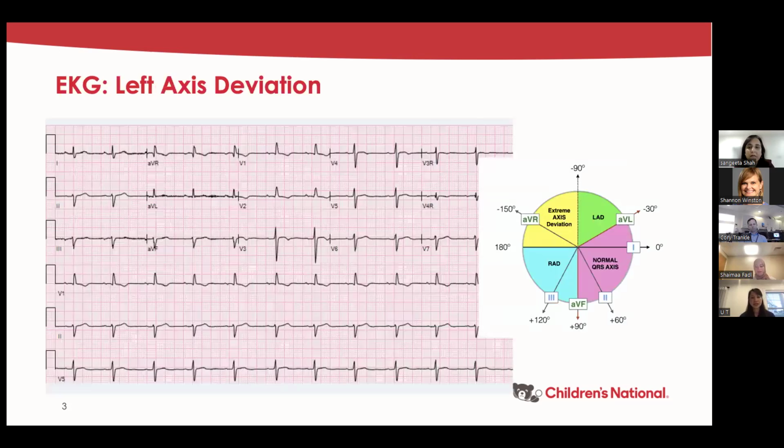Okay, so on EKG, she has normal sinus rhythm, but a left axis deviation. So when you see a left axis deviation in adults, one of your differentials should be some form of AV septal defect. Any type of AV septal defect will have this finding on their EKG. Okay, so left axis deviation again is -30 to -90 on EKG.